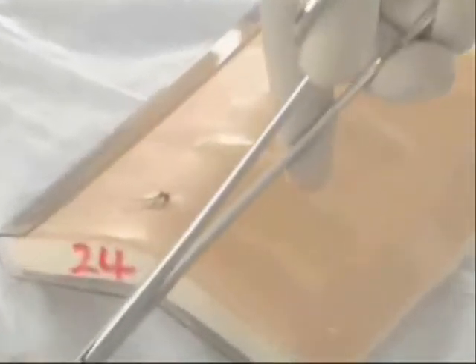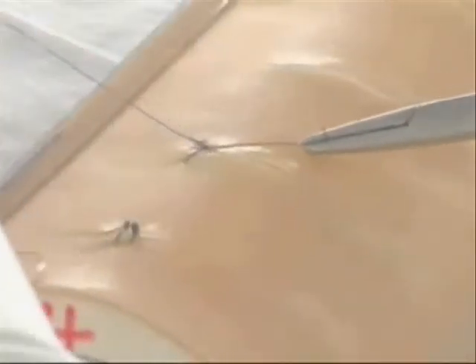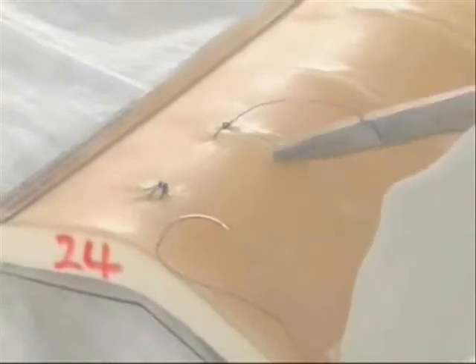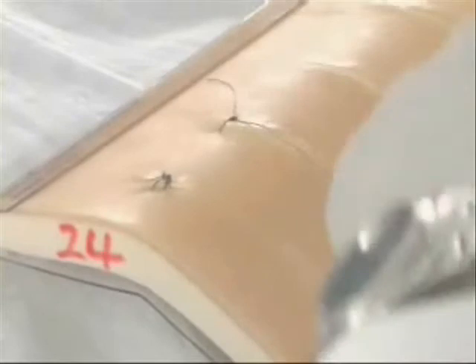If you are using monofilament it will unwind, so sometimes we put five or seven knots. Here I only cut one end — I only cut one end.